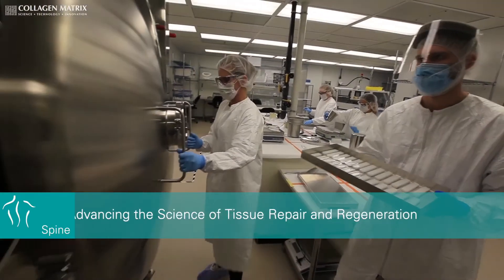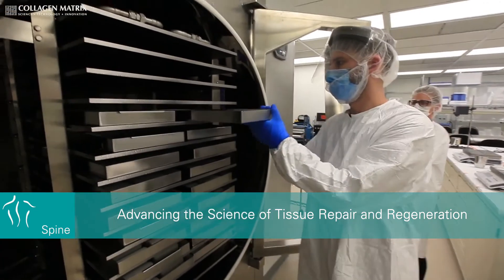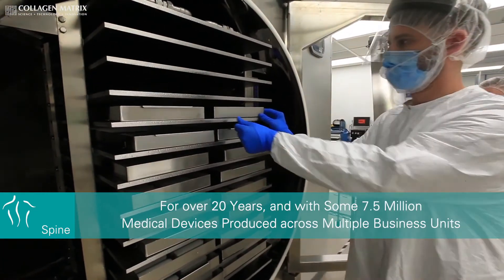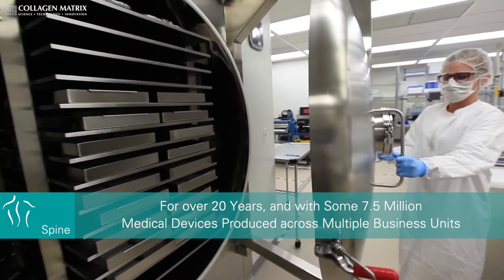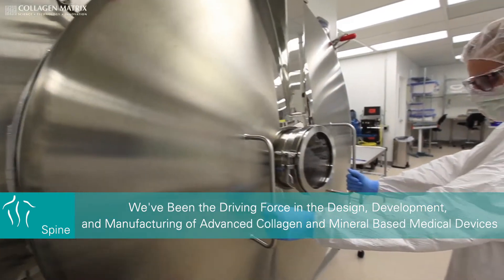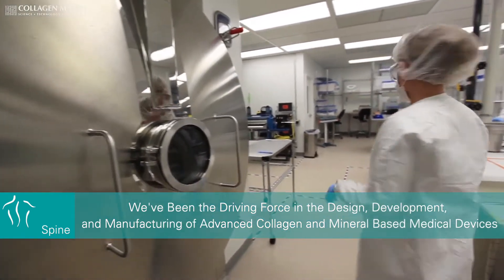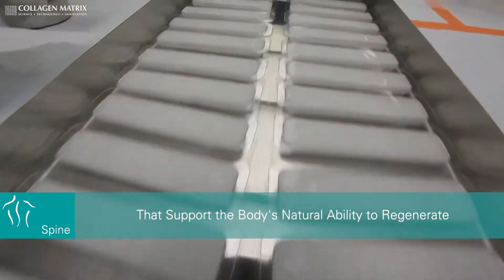At Collagen Matrix, we are passionate about advancing the science of tissue repair and regeneration. That's why for over 20 years, and with some seven and a half million medical devices produced across multiple business units, we've been the driving force in the design, development, and manufacturing of advanced collagen and mineral-based medical devices that support the body's natural ability to regenerate.